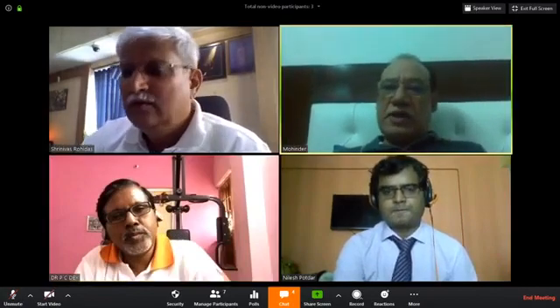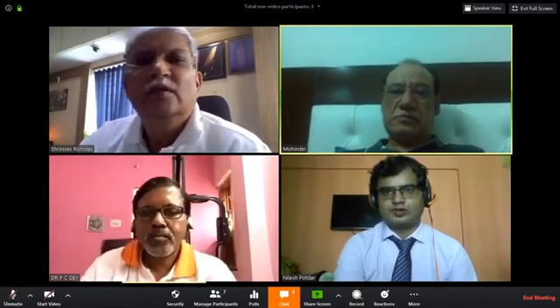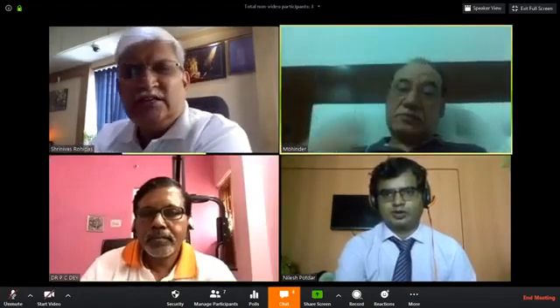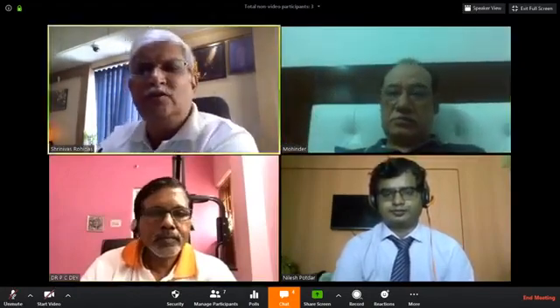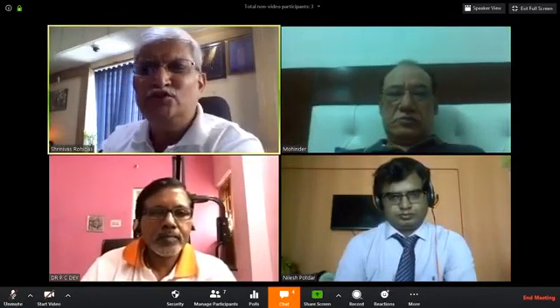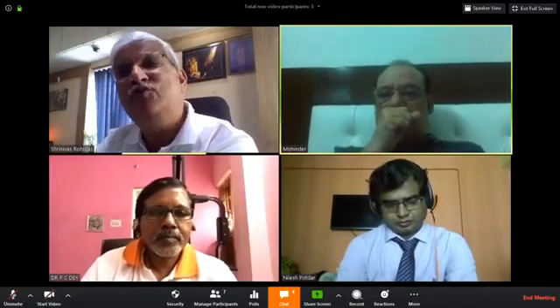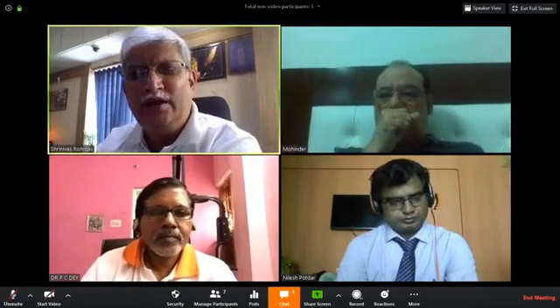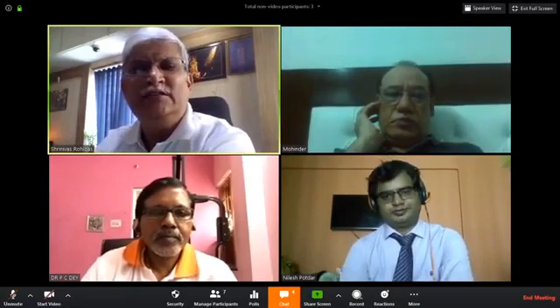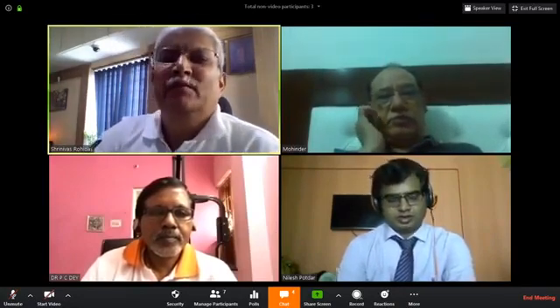Another question Mukul has asked: how to decompress adequately in listhesis? In listhesis, it is the compression of the exiting and traversing root. You have to do a good interlaminar job, go cranially, remove the part of the ligamentum flavum which is forming the superior foraminal ligament in the exiting foramen or in the neural foramen, and decompress it nicely. That is sufficient. But you have to do it bilaterally.